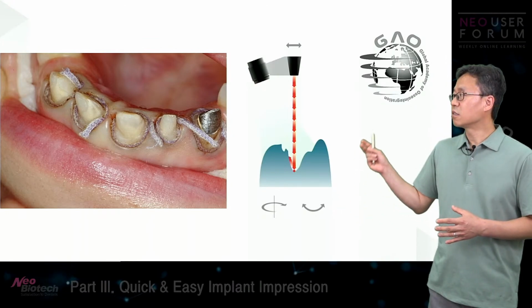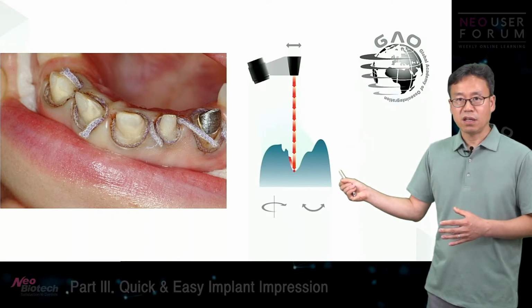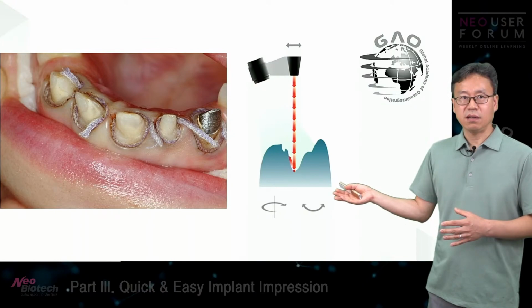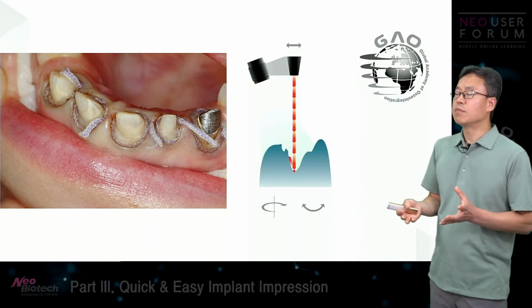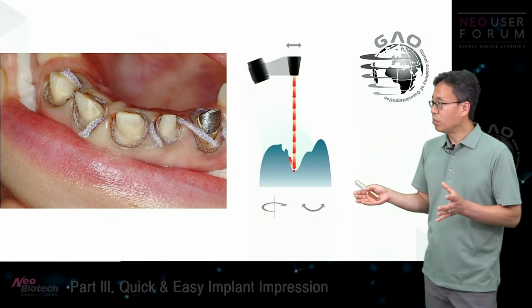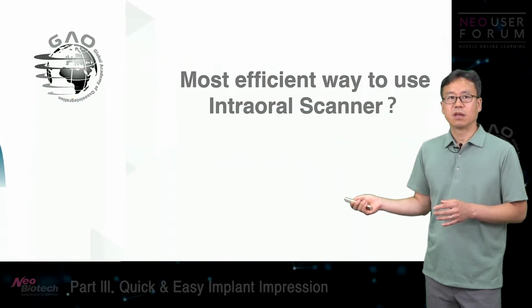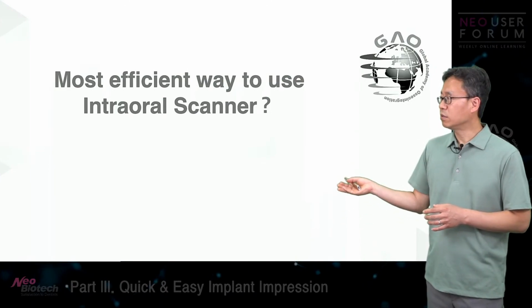Because intraoral scanning is completely pressure-free or strain-free, I would say, to have a good impression with an intraoral scanner, the margin should be visible with your naked eyes. That's why some people do not use intraoral scanners for crowns and bridges.